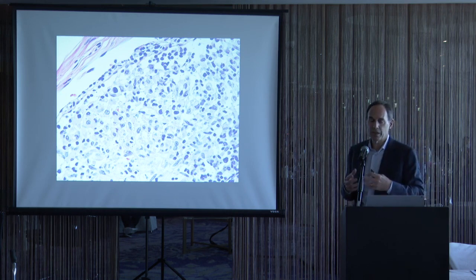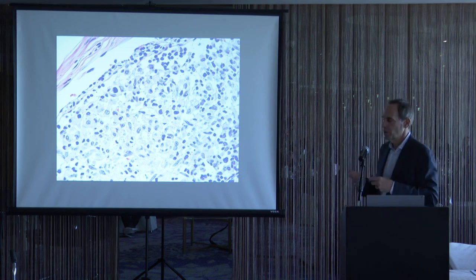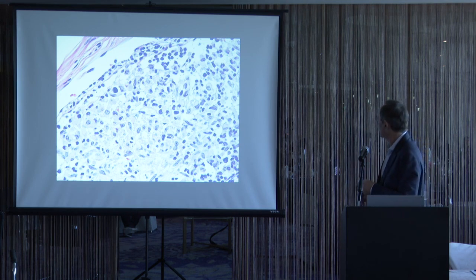Don't always expect that when you're looking for seminoma cells associated with histiocytes that you will see these nice classic seminoma cells with prominent nucleoli. They can often be these mummified hyperchromatic nuclei. This is also a hyperchromatic seminoma cell here as well. Probably a seminoma cell, probably a seminoma cell, probably one here with squared off edges.